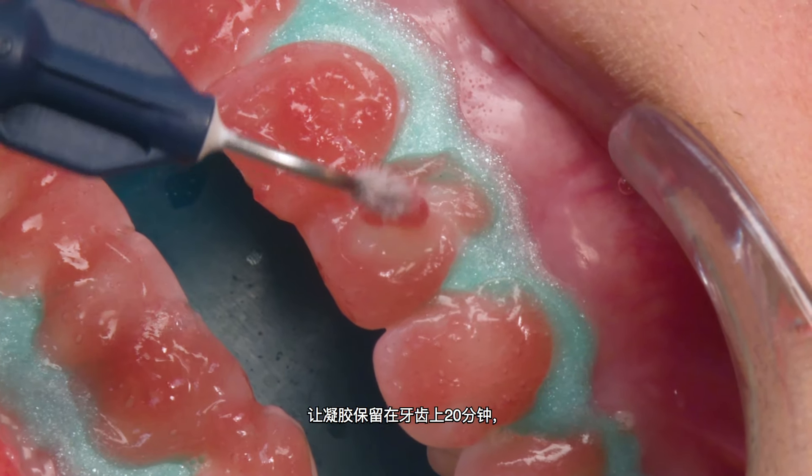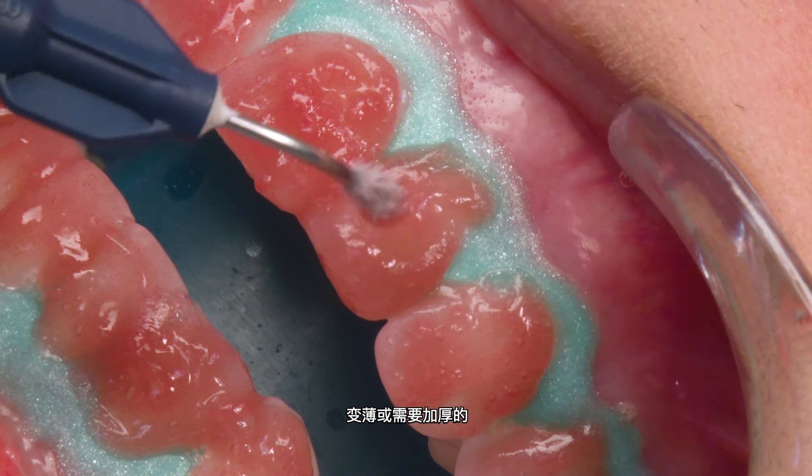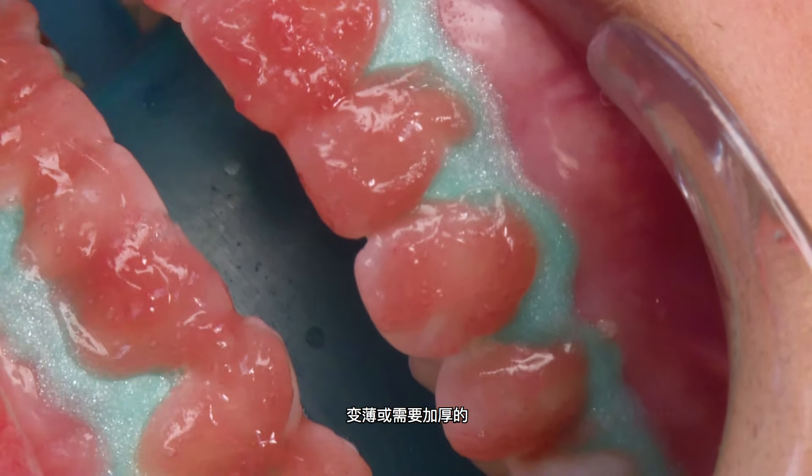Allow the gel to remain on the teeth for 20 minutes, periodically checking and reapplying the gel to areas that have thinned or need replenishing.